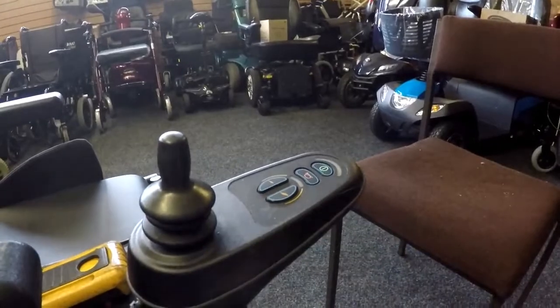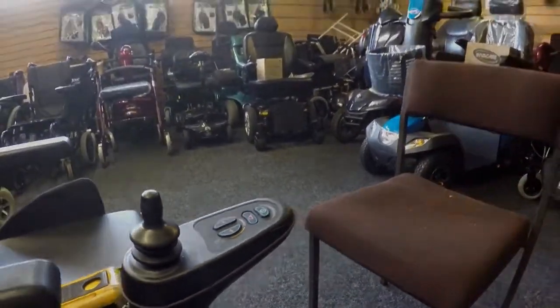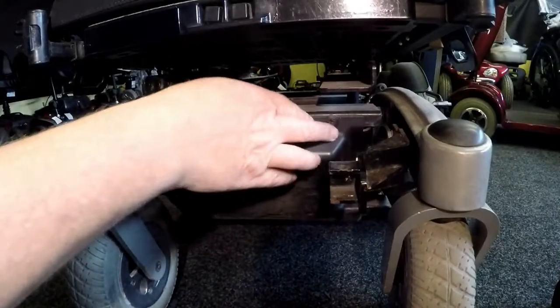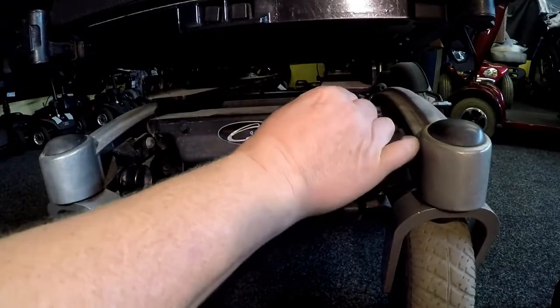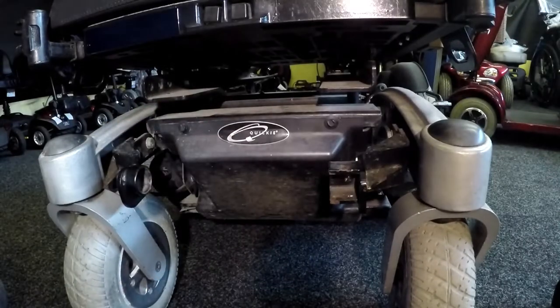It may have done damage internally onto the power module. We don't know yet until we check. Now I've removed the curb climber from here for easier access. So what I need to do is release these two. This looks like somebody's been in them before.